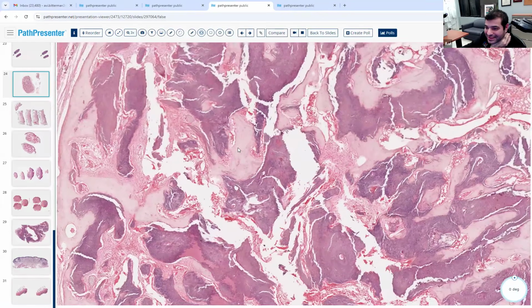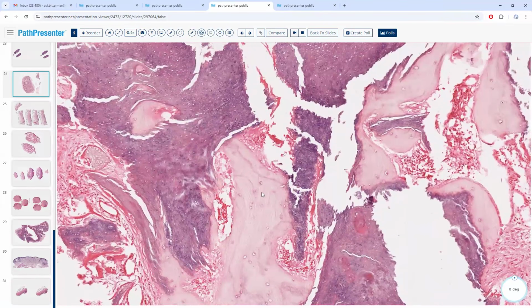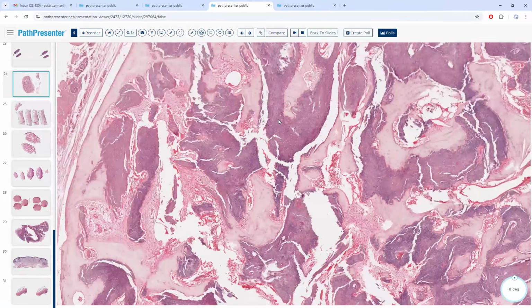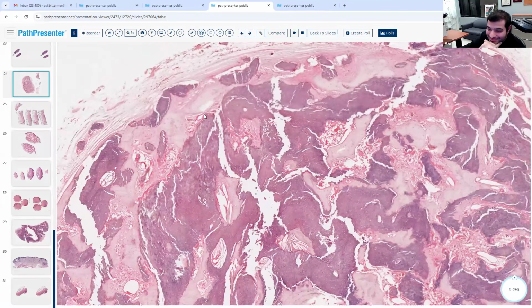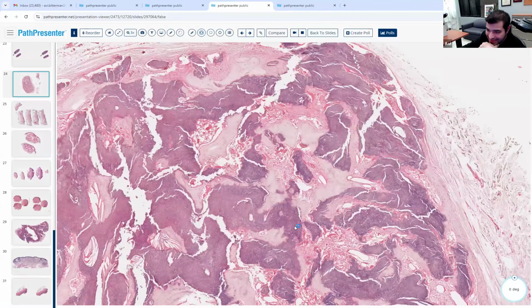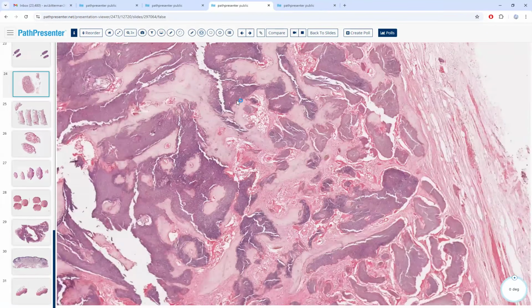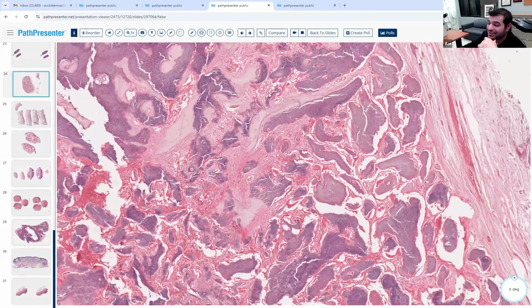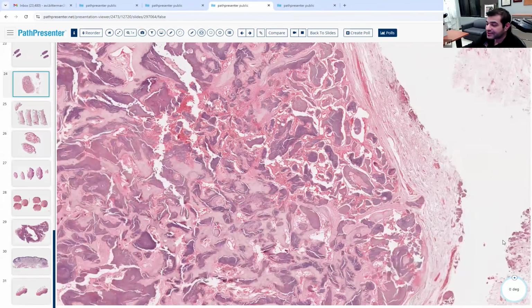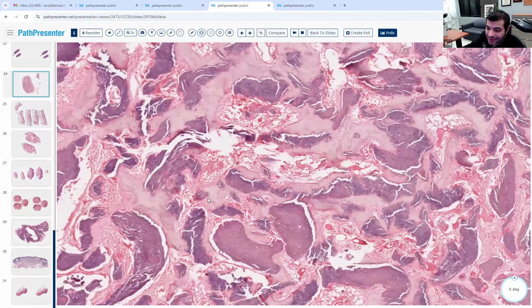So what were these things then? It looks like bone. Yeah. It's bone. And so is that normal? Can we get bone in these things? Yes, because it's all calcium. Yes, it can. Bona fide. Yes, in fact, at Mount Sinai, all of our specimens are actually bona fide, or at least some of them. So this is a bona fide pilomatricoma.